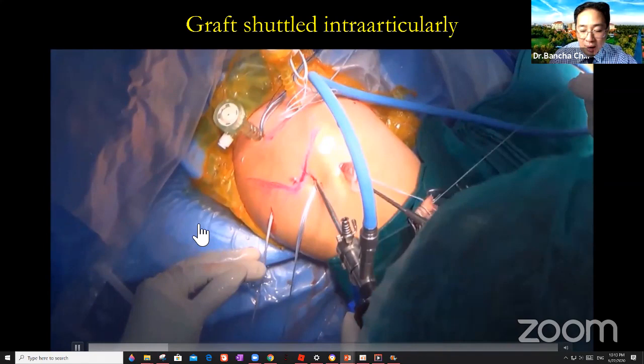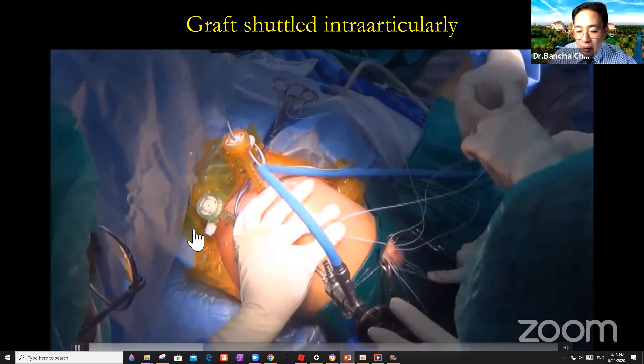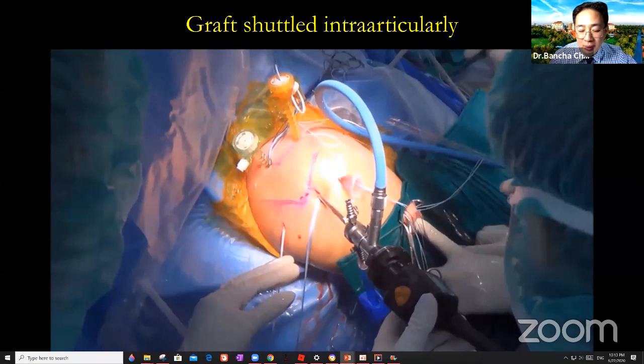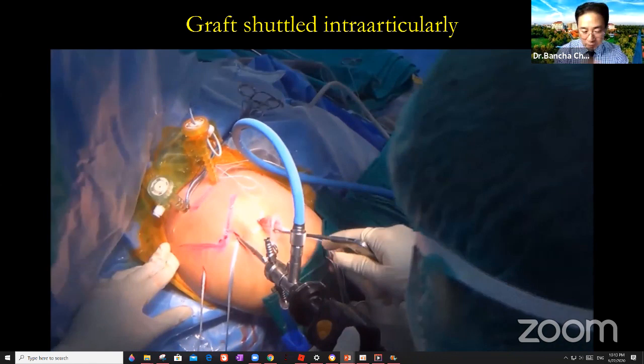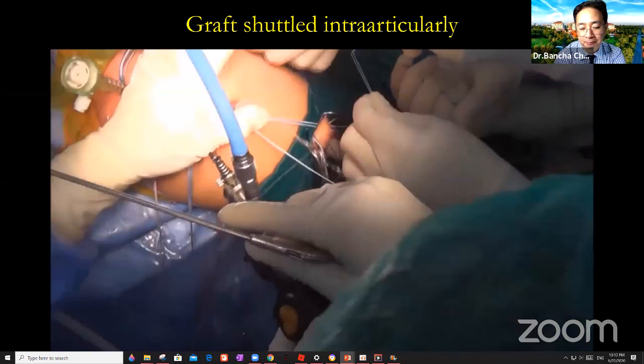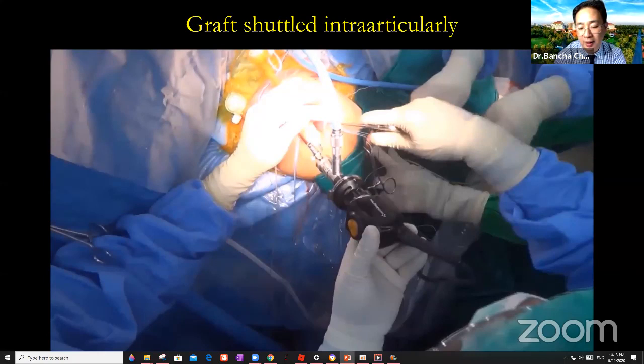Okay, you see that? We put the suture. We take two sutures, pass into one hole. That way, okay? We do that one by one. So you need to be careful, the suture can tangle. So put it one by one like that. Okay, good. So all these sutures will be in the same hole. So that's why we need to use the big cannula.